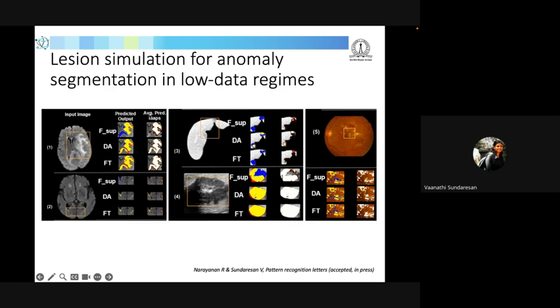We also computed average prediction maps by blurring the images and then using the same model. Oftentimes, what people usually do not do is quantify the uncertainty of the model. When the model makes a prediction, we need to know the confidence level of the model for making that particular prediction. So that is what we wanted to determine. We blurred the image at different sigmas using Gaussian blurring, applied the model across all the images, and these are the averaged results.